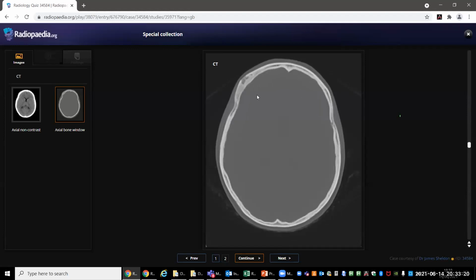Okay. Dr. Rasheedah, your voice becomes muffled sometimes. Oh, okay, sorry. So if you have an MR showing abnormalities in the bone, you need to ask for a CT. That's the only way you can cone down your differentials, because they can have very absurd appearances at times, and you may not be able to tell what is actually going on.